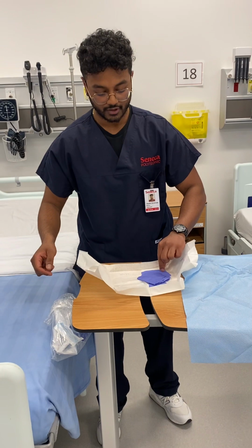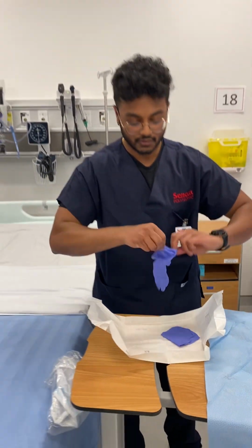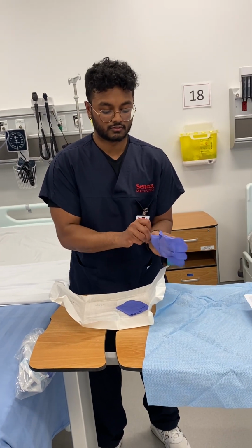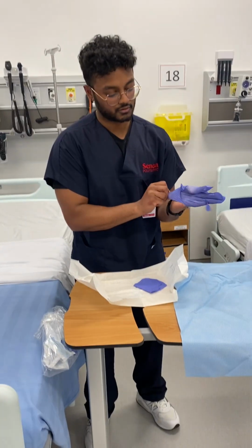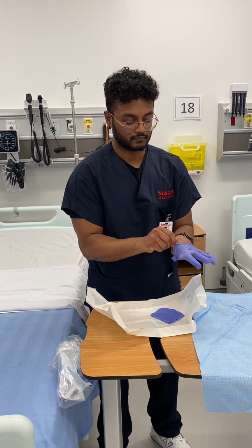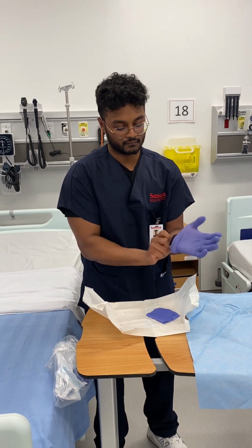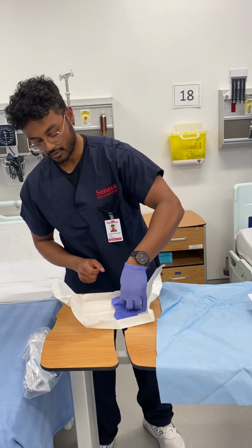Now we'll begin by grabbing from the inside. As this is clean, we're able to grab it with our fingers, beginning with the dominant hand. Because we can touch on this side, we make sure to grab on the inside.